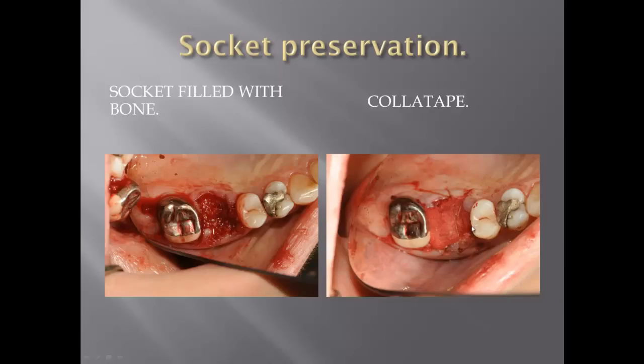Sometimes, if I see in this area a deficiency, or missing teeth and a deficient ridge area, I do socket preservation and ridge augmentation at the same time and try to split the buccal flap and get primary closure. But if I do just regular socket preservation, I don't split, because I don't want to interrupt the blood supply from the periosteum to the buccal wall.